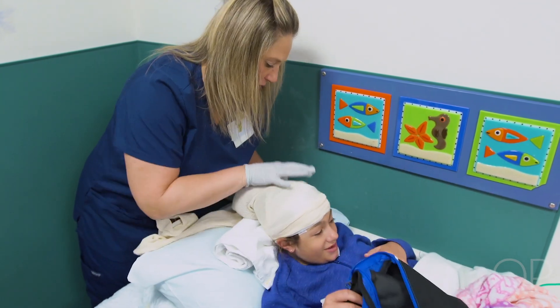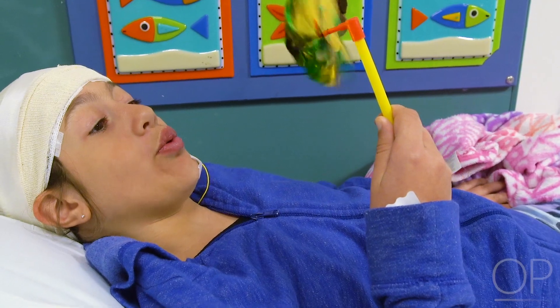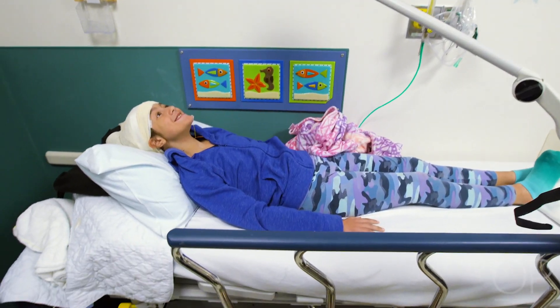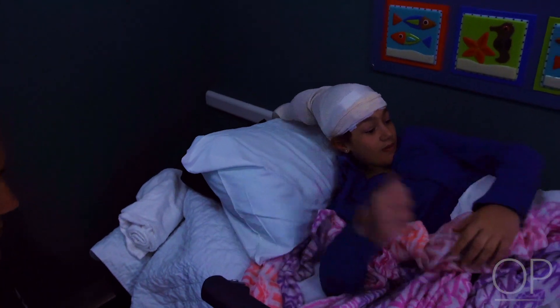The technologist will tell you how long the test will take. They may ask you to do some things like take deep breaths or look at flashing lights during the test. We will also ask you to take a nap to record your brain waves while you sleep. Other than that, you don't have to do anything at all.